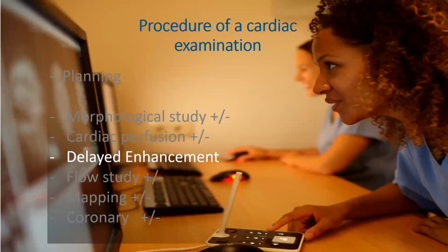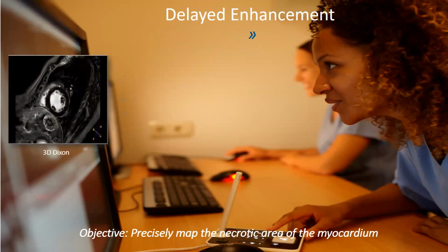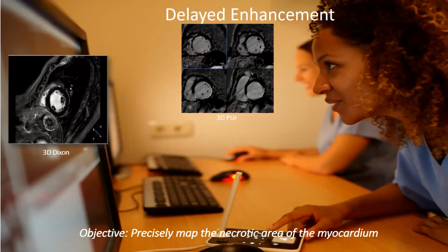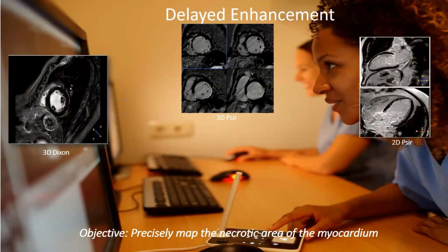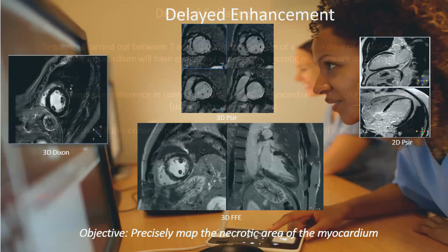Now we talk about the delayed enhancement. The objective is to precisely map the necrotic area of the myocardium by using some advanced sequence like 3D Dixon or the 3D PSIR, phase sensitive inversion recovery, or 2D PSIR. We can also use the 3D fast field echo in Philips. Here we can use multiple sequences to do delayed enhancement.